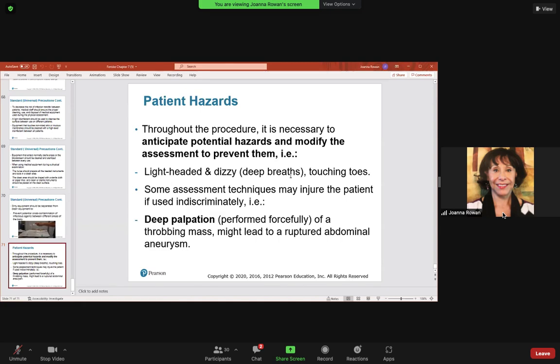That is the reason why in real life and for your physical assessment skills validation, you will have to auscultate only 6 areas in the front, right below the clavicles, right below the breasts. If you have a female patient with large breasts, and if the patient is alert and oriented, you ask the patient to lift her own breast. If the patient is not alert and oriented, you, the nurse, can lift the breast utilizing the back of your hand, not the palm of your hand, the back of your hand.